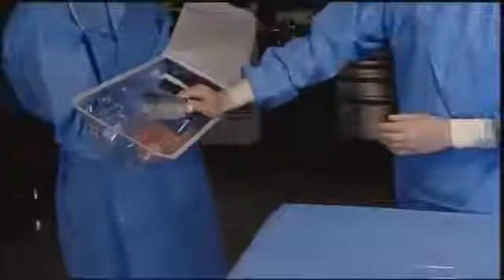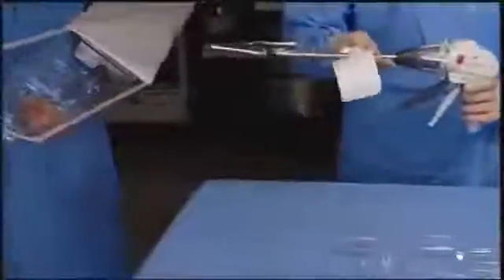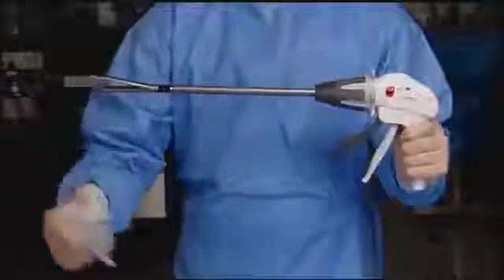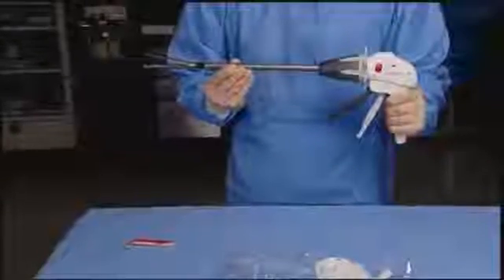To load the instrument, using sterile technique, remove the instrument and reload from their packages. To avoid damage, do not flip the instrument or reload into the sterile field. Remove the multiple-stroke firing instructions tag from the instrument's firing trigger. Prior to loading, ensure the instrument is in the open position.